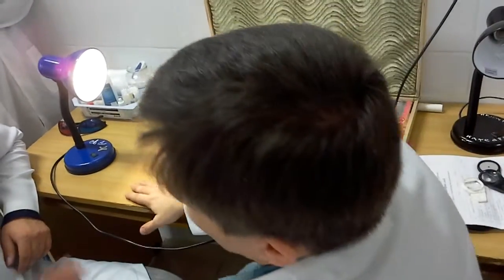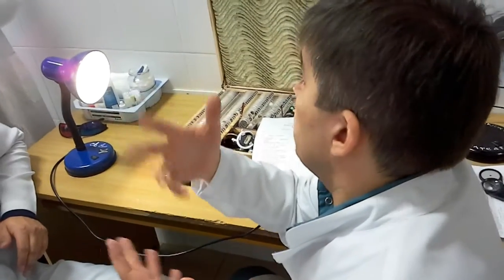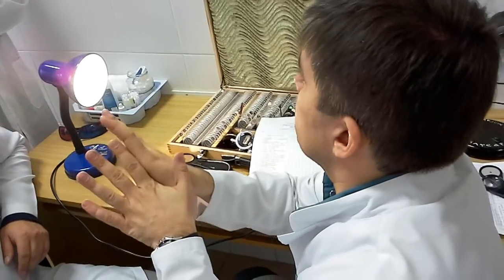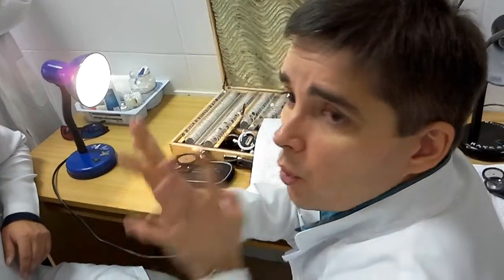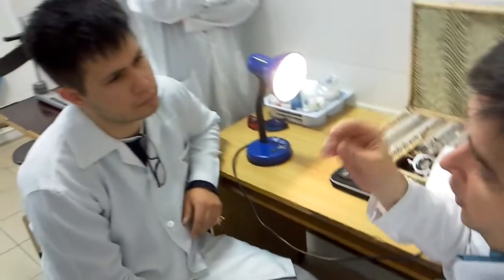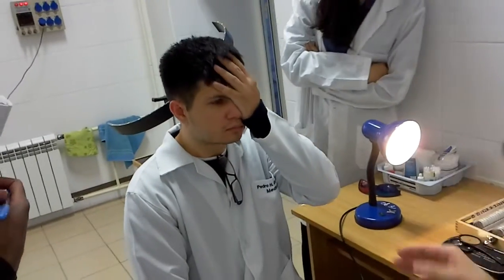For example, during our class work, of course, we just simulate the situation. Let's imagine that our patient has normal vision of the left eye, or subnormal, but very poor vision of the right eye. He can't count my fingers even at a distance of several centimeters. It's necessary to check light projection on his right eye. Okay, cover your left eye with a palm in such a way.